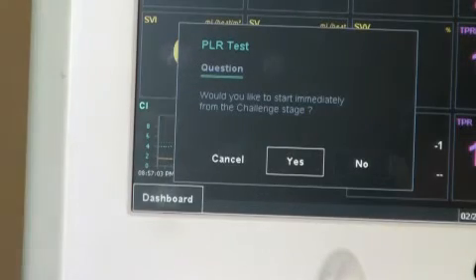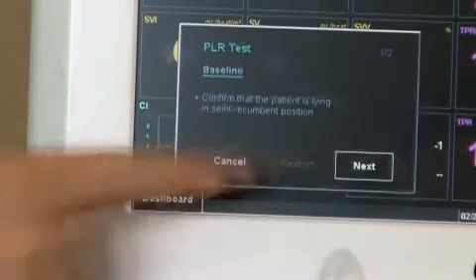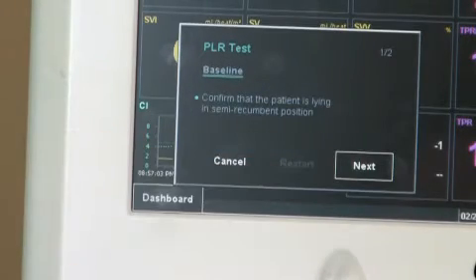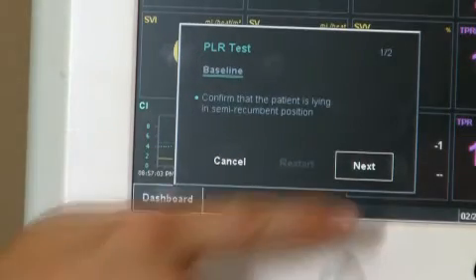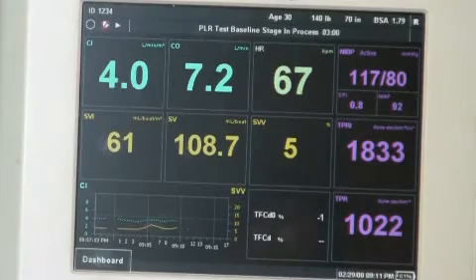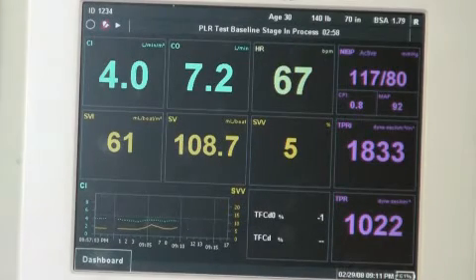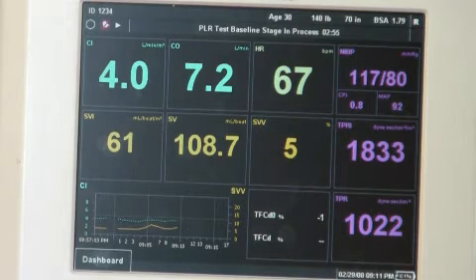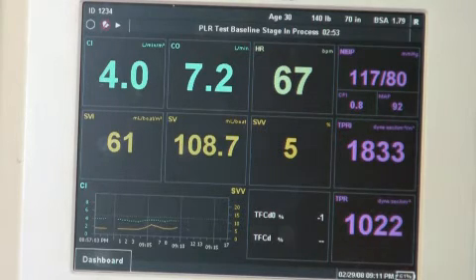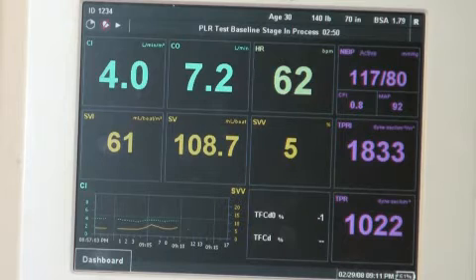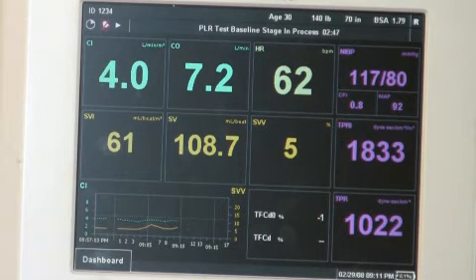Follow the prompts and confirm the baseline reading, then hit Next. The machine will take another NIBP reading — this is part of the protocol. Now the machine will start the test. The screen will say PLR Test Baseline Stage and Process, and the 3-minute countdown appears on the top menu bar.